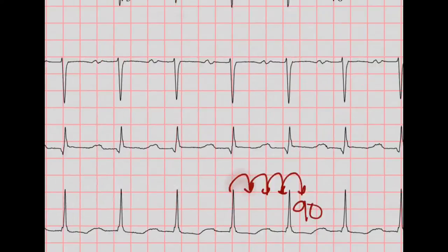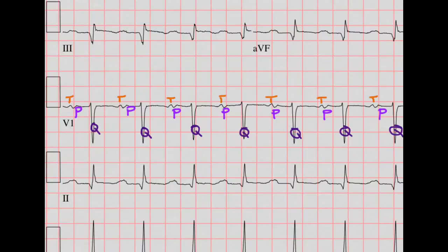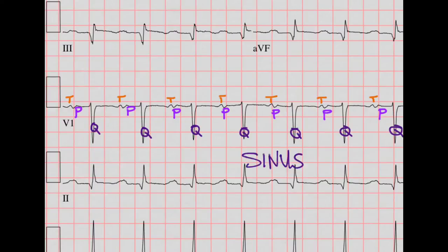Now let's do rhythm. We're going to see that there's a P for every QRS and a QRS for every P, so I like to label them. This one is a little bit confusing because the T and the P are so close to each other. But there is a P for every QRS and a QRS for every P, so I would call this a sinus rhythm.